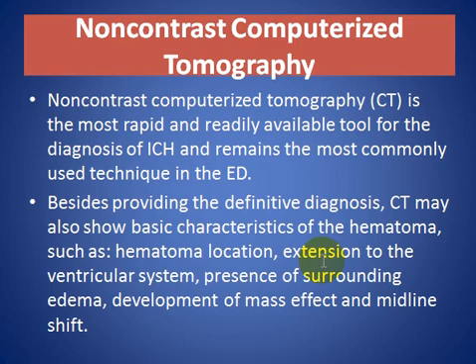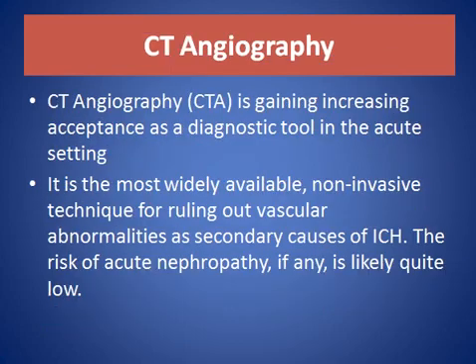CT, non-contrast CT, is the most rapid and readily available tool for diagnosis of intracranial hemorrhage. It provides a definite diagnosis and also shows basic characteristics of the hematoma, like location and extension to the intraventricular system, and surrounding edema and midline shift.